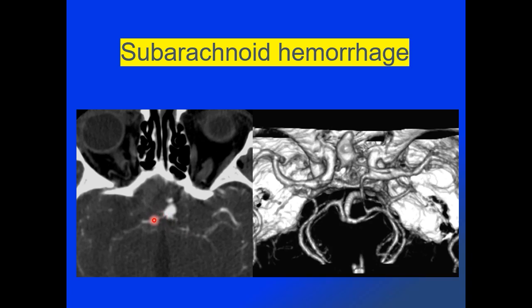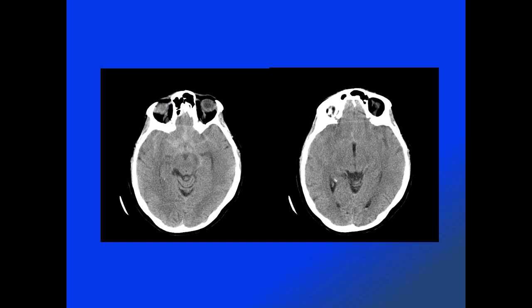This patient also had an anterior communicating artery aneurysm on CTA, and a 3-dimensional reconstruction image nicely demonstrates an irregularly shaped aneurysm with a small daughter sac or daughter aneurysm, which may be the source of the rupture.